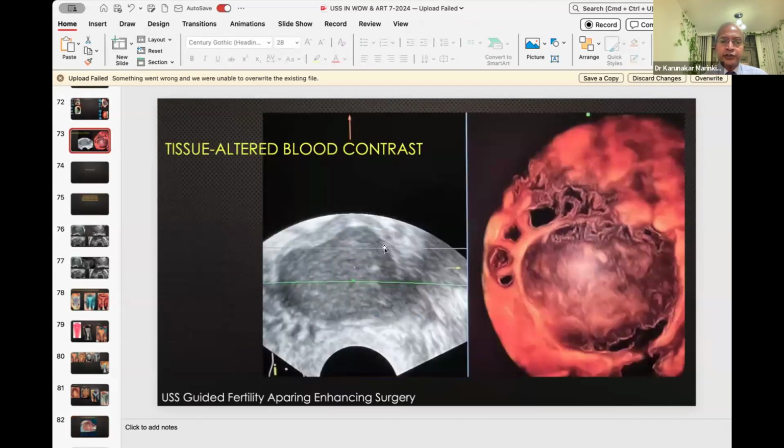Now, if you see endometriosis, you need to understand nowadays, if you do 3D for endometriosis, this is a typical 2D, and now you do laparoscopy, you just do whatever you are trained to do. You just pull off everything, you do enucleation, you do cautery, whatever. But if you can do 3D even before the laparoscopic surgery, you see there are 4 antral follicles between 9 o'clock to 12 o'clock. You can avoid doing too much diathermy there.